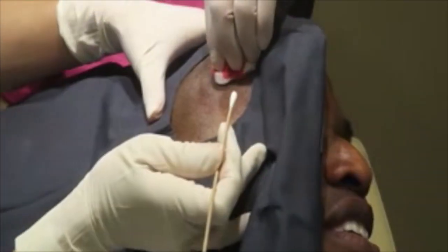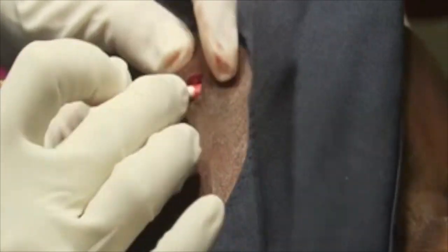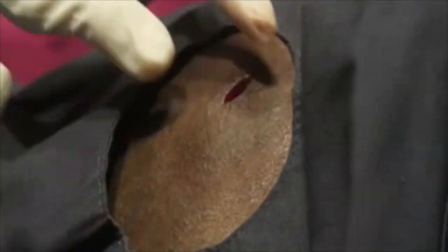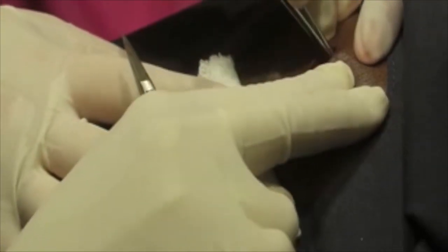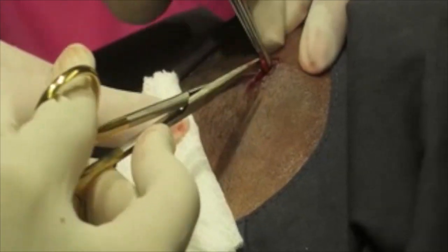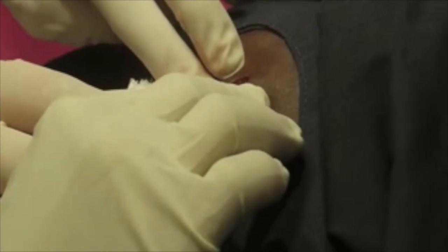Try to make sure we got it all here. I'm going to turn you back towards me just a little bit. There you go. Like a suction thing that you just stick in there? No, suction is not really going to work here. Suction is really good for fluids. Just trying to make sure I get all of it. I think it's a little wider than that, which is why I use my Sharpie to mark out how big it is, because sometimes you can't see it so well when you start the surgery. So I'm going to move around now.